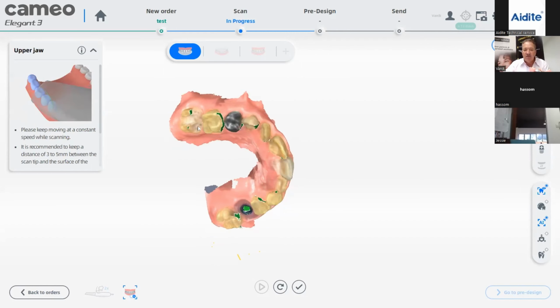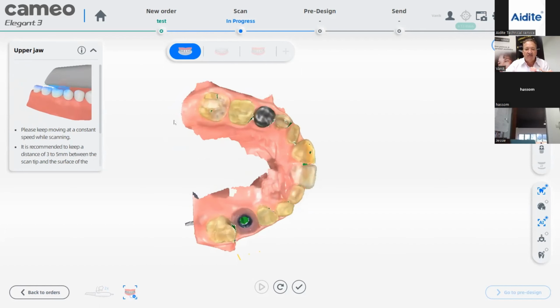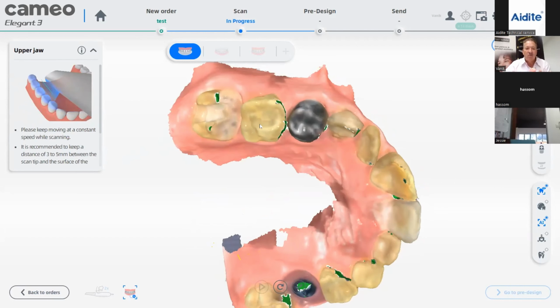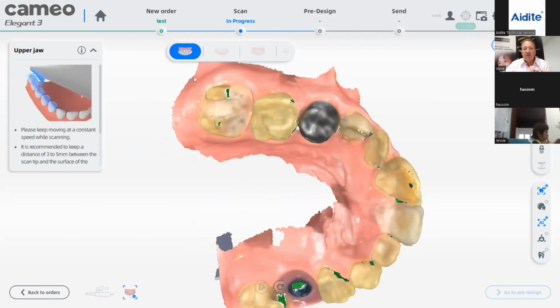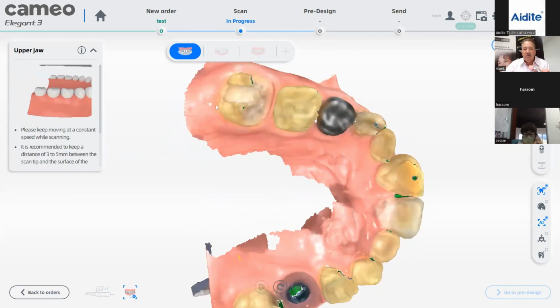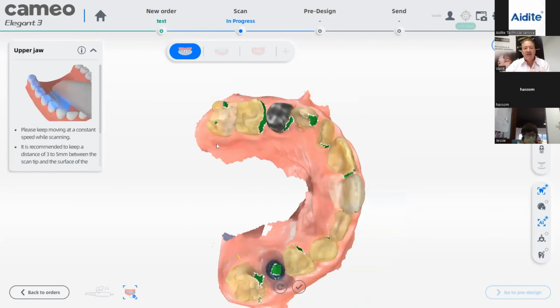Now we can go and fix all those issues. Everything which is green is important for us. In this case, normally this will be, let's say, the crown or the filling which you want to do, and so we would have to get this fixed. I would not bother about these areas anymore because this is where the crown is and the contact is also good. The software would fix the rest. But if you want to be perfect, naturally you want to fix those areas. I've made a model here, like a child model with a metal crown and an implant. The child never has an implant, so I can demonstrate everything.